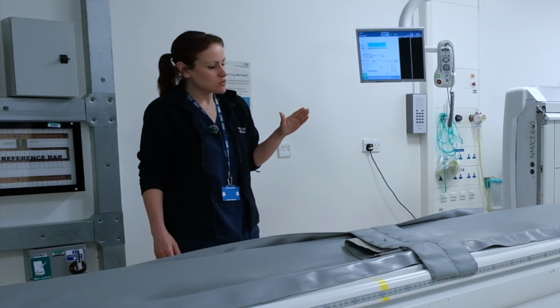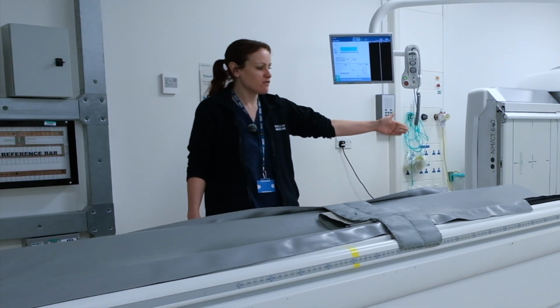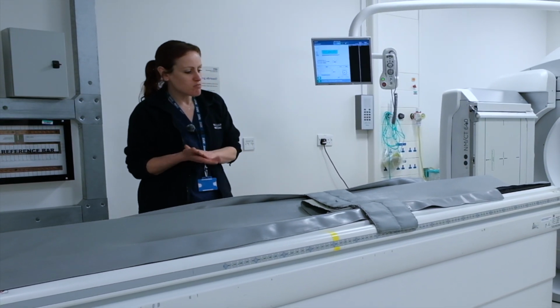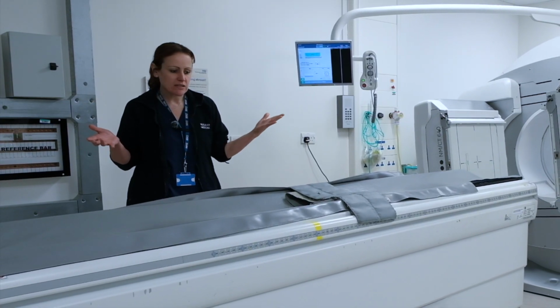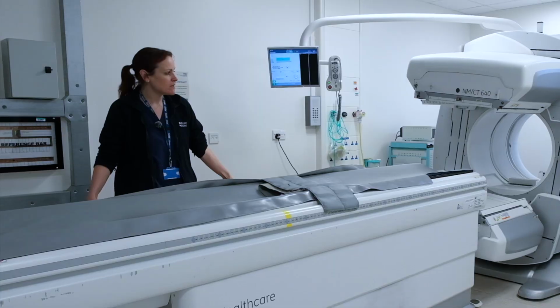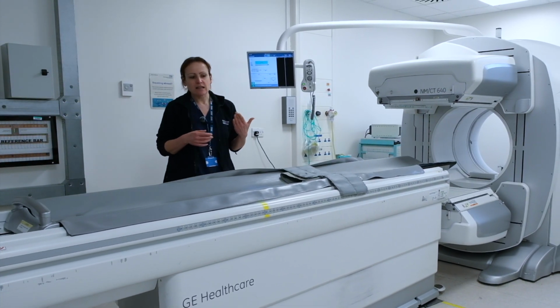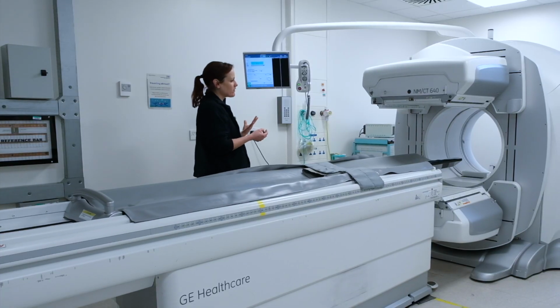For a lot of the patients, we would start off and do a whole body, so from the top of the head to the bottom of the feet. If it was a joint prosthesis scan, we may reduce that scan. For example, if they were looking at a knee replacement, we would just scan from the hips to the feet. So you have to review the clinical information to see what area we'll be focusing on.